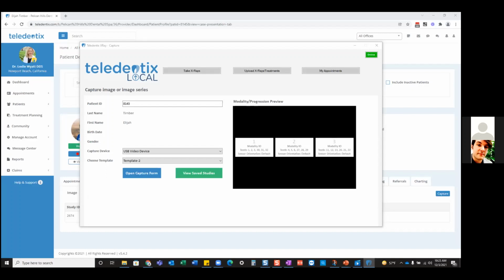All right. Another question. How can you do anything offline if you have to get online first? That's a great question. And really the trick there is that you do that prep work before you go out. If you want to do it the day before, please do. If you want to do it the morning of, please do. The point is you do have to have an internet connection prior to doing anything offline. It does require that prep work that we talked about.